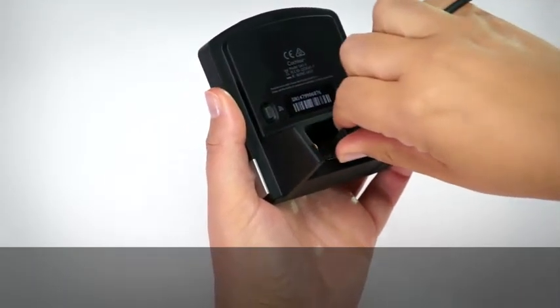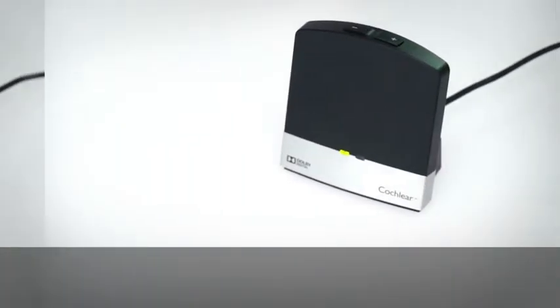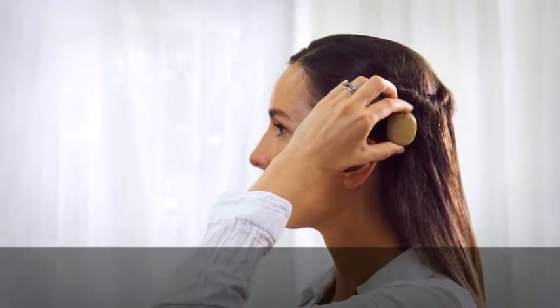Plug the power cable into the micro USB socket on your TV Streamer and connect it to the wall power outlet. The TV Streamer power indicator will light green.